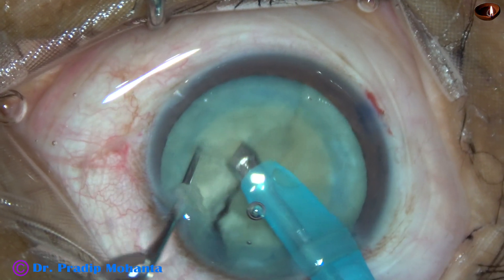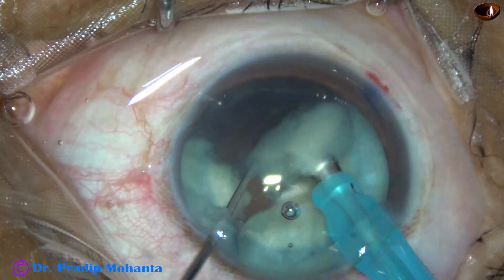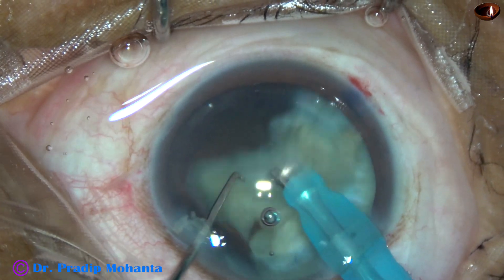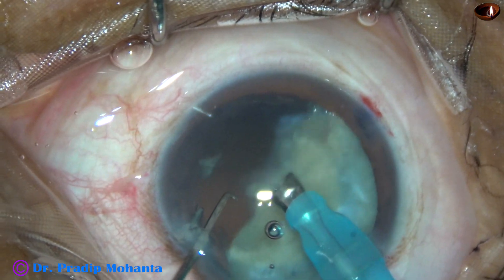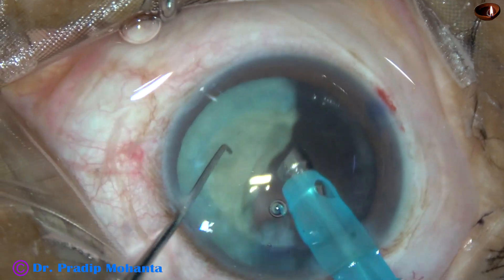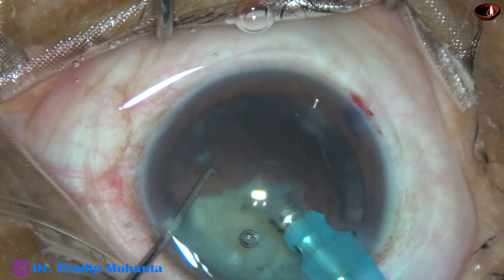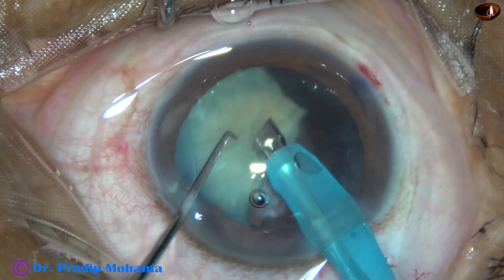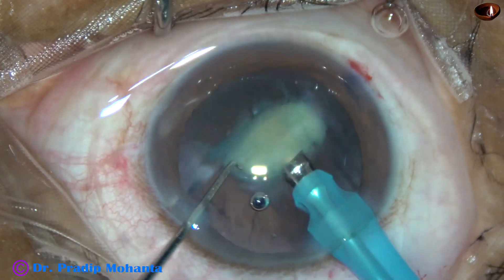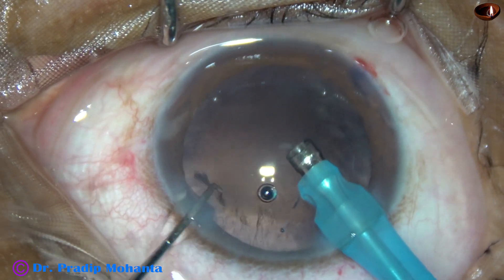The nucleus is divided completely into two heminuclei. Each heminucleus is being subdivided into smaller pieces. The pieces are emulsified using ultrasonic energy, which in this case is 65%. Flow rate is 45 ml per minute and vacuum is 450 mmHg. This is chopping of the other heminucleus, which has been chopped into three pieces.